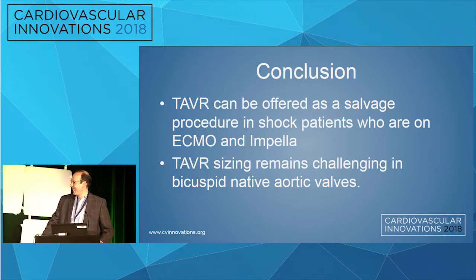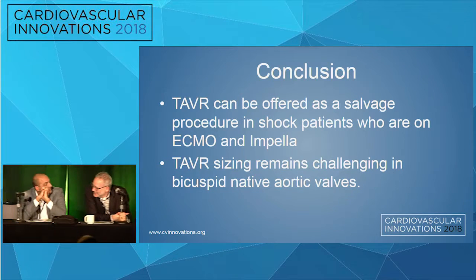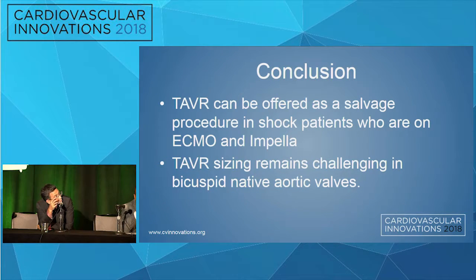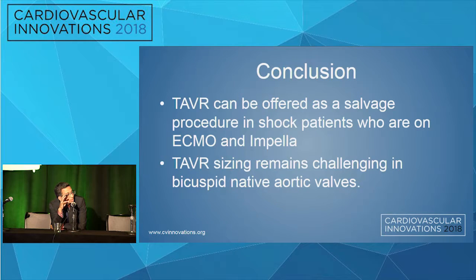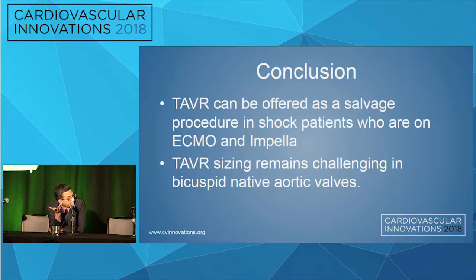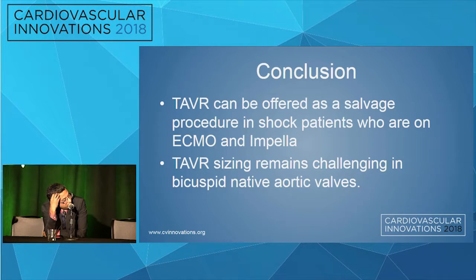The one thing that you may want to do, instead of using an Impella to unload, you can use a transseptal catheter from TandemHeart and just use it from the right and left so that there's nothing across the aortic valve. So that system works a little bit easier and better. Both of them cost the same because they don't sell the left atrial cannula separate from the TandemHeart. So you don't need the TandemHeart, you just need the cannula. Right. But unfortunately, that is not. But outstanding case. You can put a PA sump in there, and a PA sump will drain what gets past your cannula and decompress it.